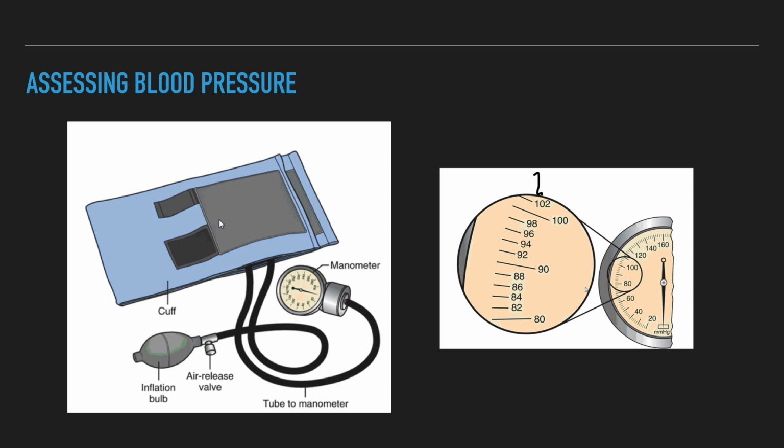Equipment. There are several different pieces of equipment that can be used to measure blood pressure: the sphygmomanometer, stethoscope, Doppler ultrasound, and electronic devices. Sphygmomanometer. A sphygmomanometer consists of an inflatable bladder enclosed in a non-distensible cuff. The bladder is connected to an inflating mechanism such as a bulb or pump, a valve for deflation, and a manometer. The manometer may be an aneroid or gravity mercury type.